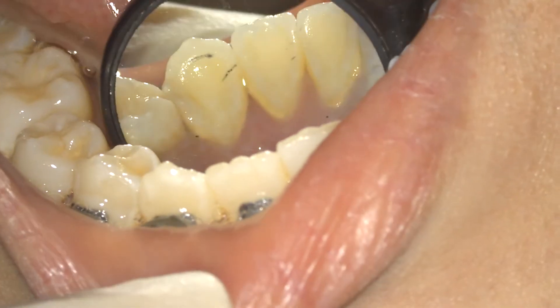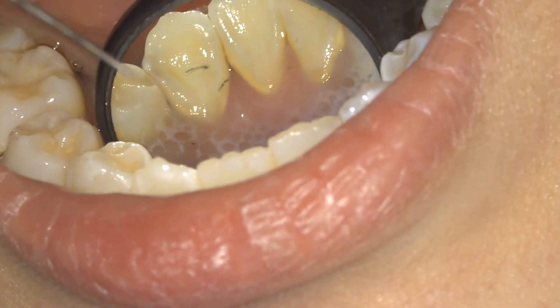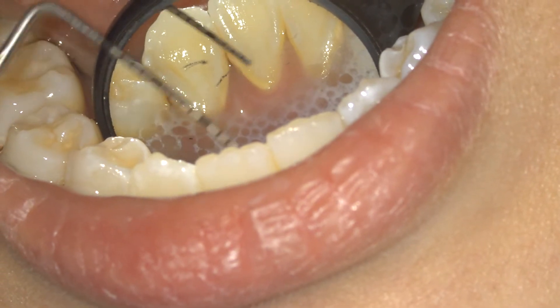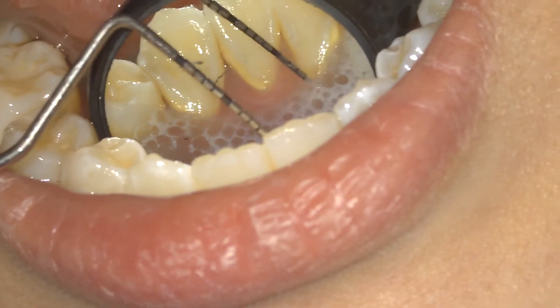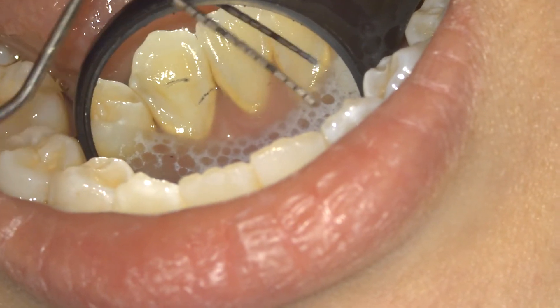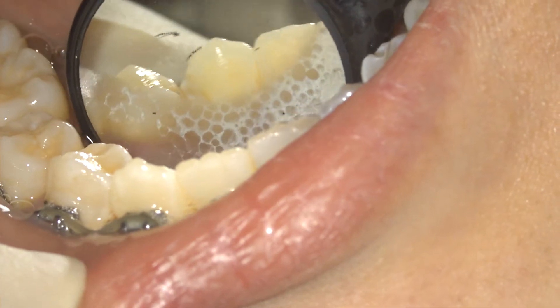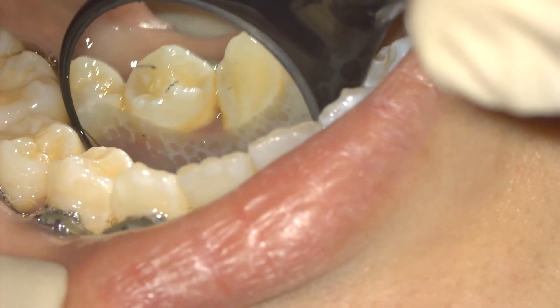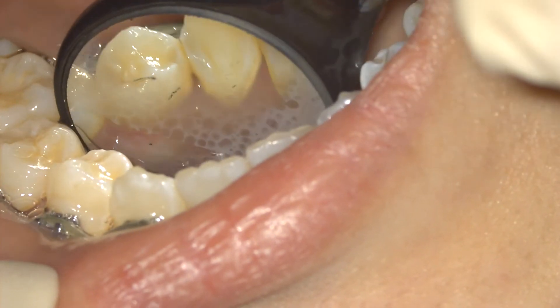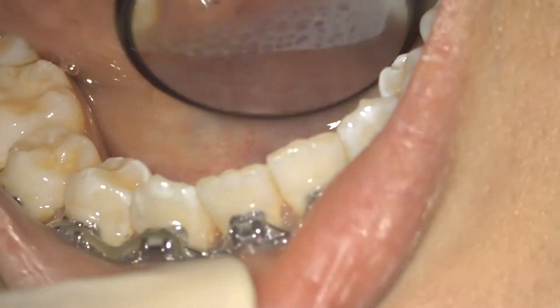As you can see, there is calculus present — the yellowish deposit around the cervical margin of the teeth is the calculus. It need not always be yellowish or blackish in color; it could sometimes be whitish or creamy white. You can see calculus present all around the cervical areas of the teeth.